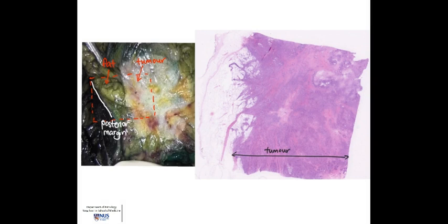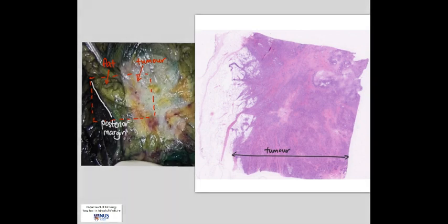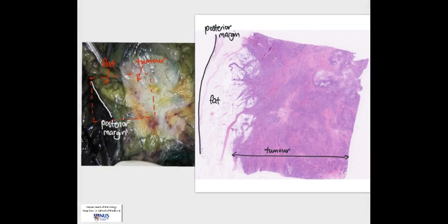This is the histological image of the tumour on the right and the corresponding gross image on the left. At low power, the tumour occupies the whole of the pink area and appears to infiltrate the adjacent fat. The tumour is some distance away from the posterior margin, which corresponds to the gross section.